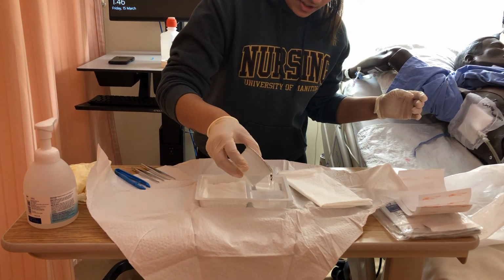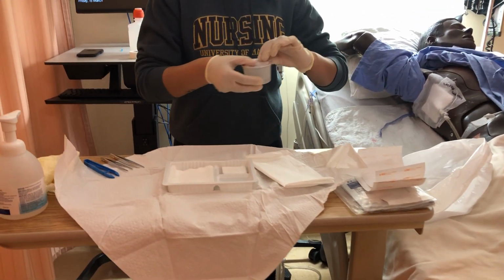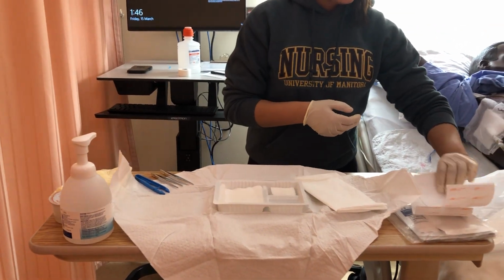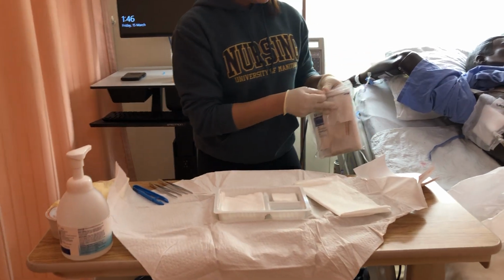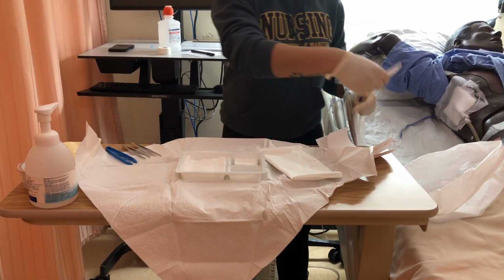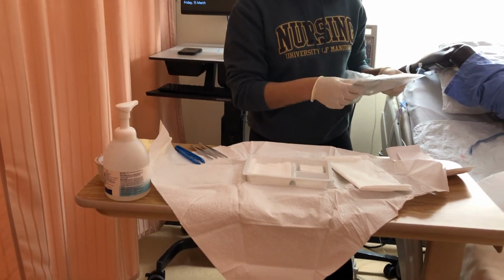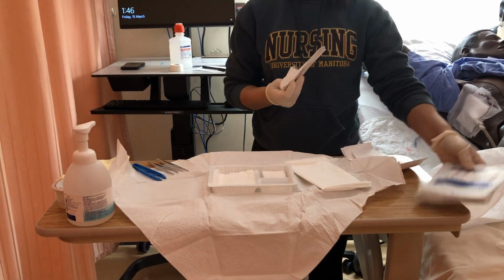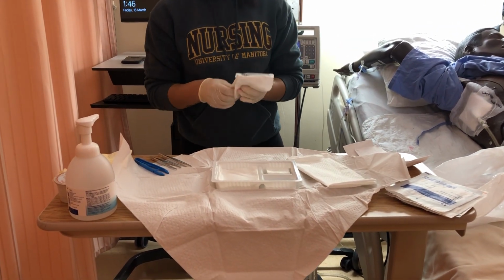Just making sure not to touch the mouth of the normal saline. I'm going to put this to the side. I have mefix here, and I grabbed extra, 1, 2. And on this mefix, I've updated my name and initials, so the next nurse knows when to change it. I'm going to grab an extra pair of forceps just in case I do contaminate my field.